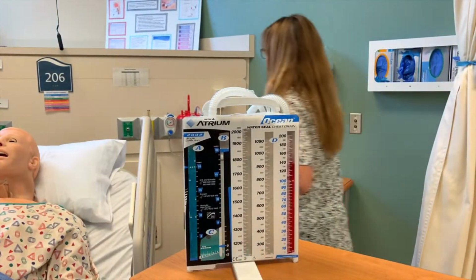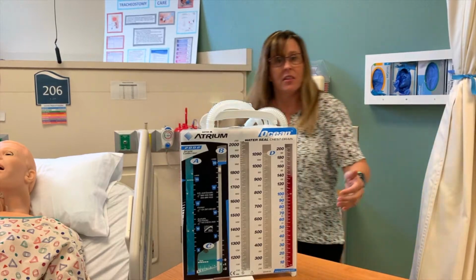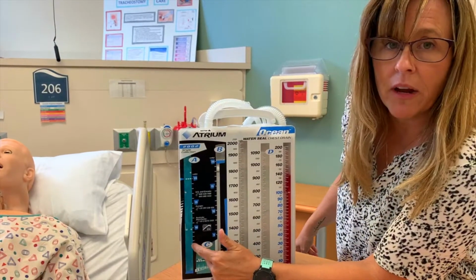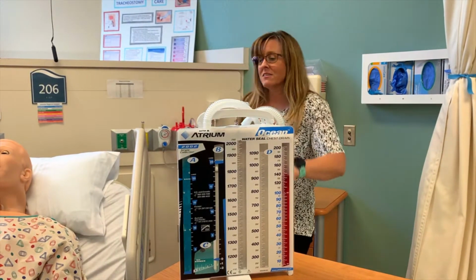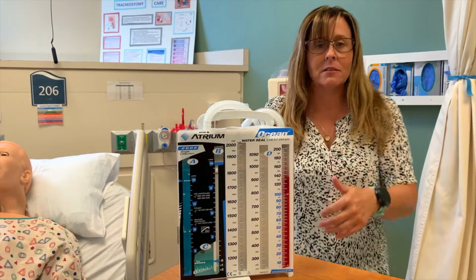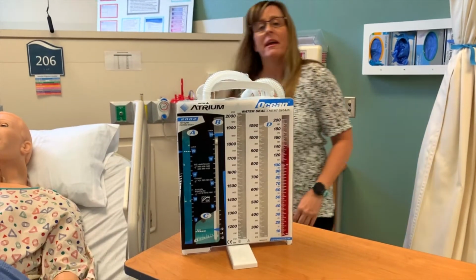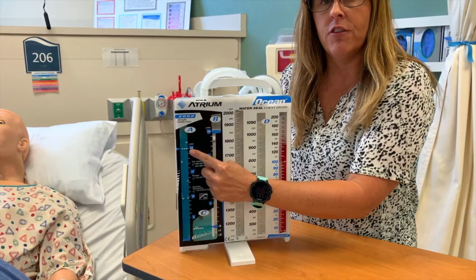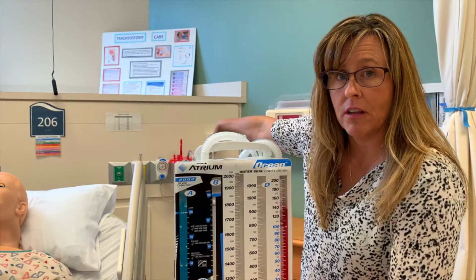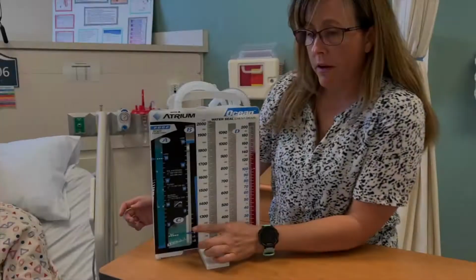Now, I can go to this wall suction and I can make it go higher, but the only thing that that does, guys, is that increases the rate of evaporation. It's no bueno. We don't want that to happen. So what I'm gonna do is I'm gonna have a nice little constant bubble like that, right? Nice constant bubble. And remember, what makes the suction work and the amount of pressure is that magic number you fill it to, all right? If you don't fill it to this number, then you're changing the pressure that's prescribed for the patient. It's not the wall suction that's creating the pressure for the patient, it's the amount of water that you have in that suction control chamber.